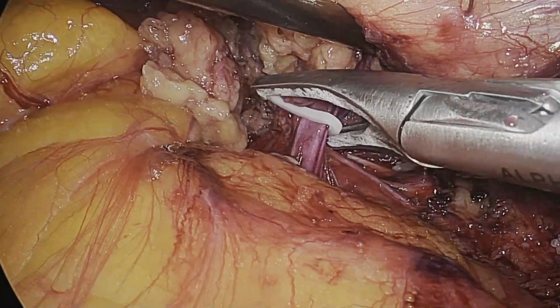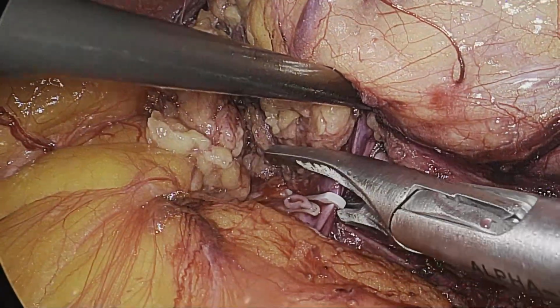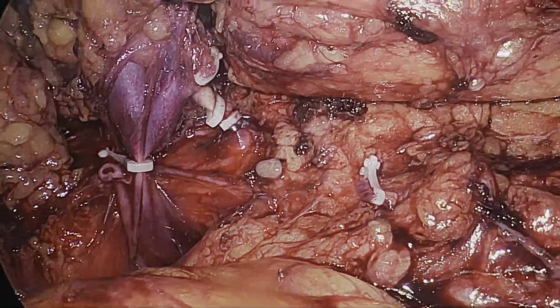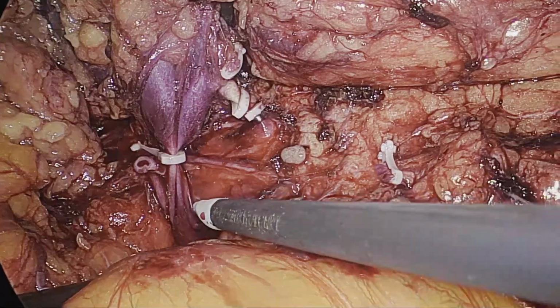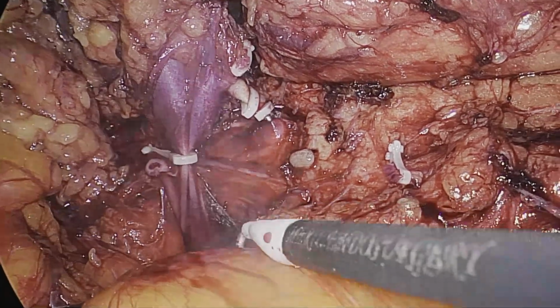The lymphatics behind the renal vein are giving us some difficulty in applying the clip, and a lymphatic strand was caught in this clip. So we decided to move a little proximal to apply a more secure clip in this case.